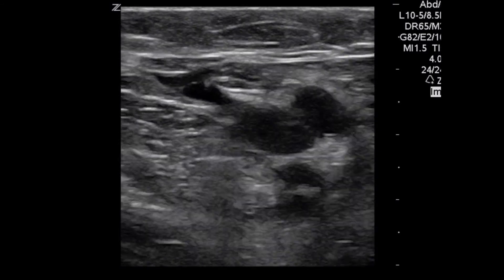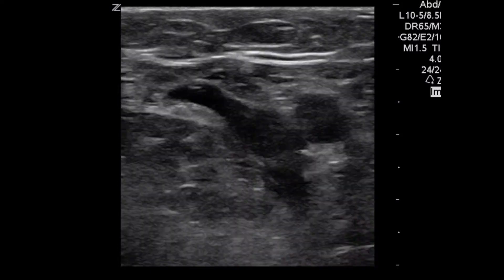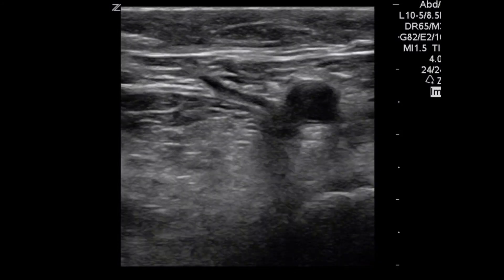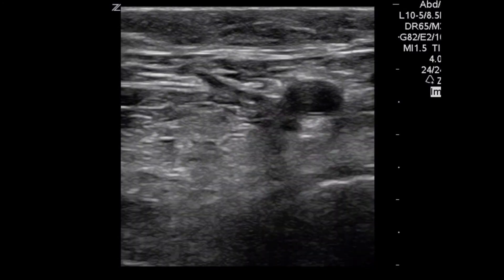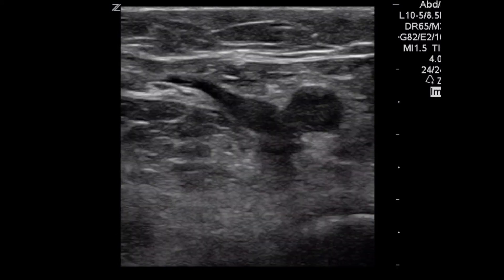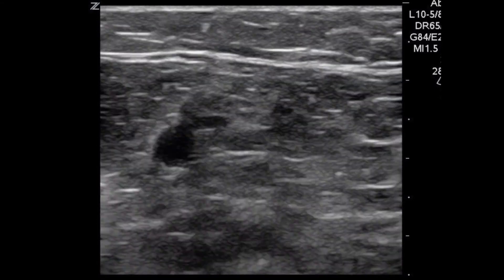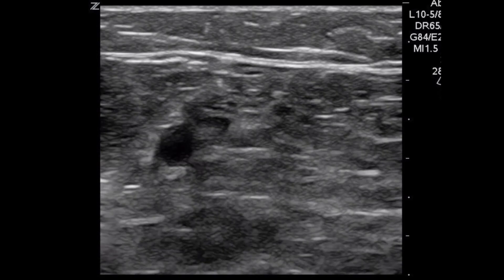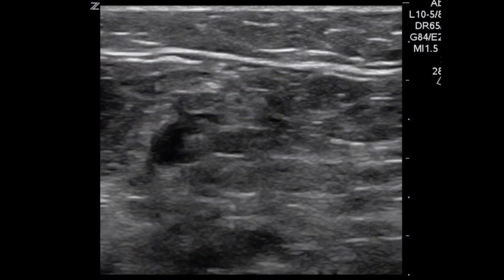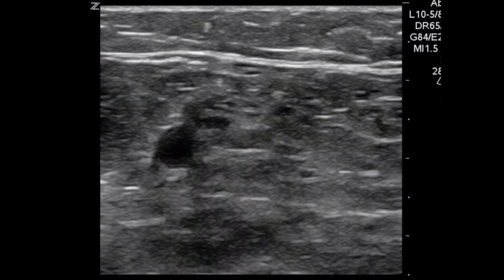Here we are at the common femoral vein region. We're seeing the saphenous vein shoot off from the femoral vein, and you can see the femoral artery as well. What we're doing is compressing — we get those veins in view and push straight down into the patient. If the veins compress 100%, there's no thrombus. If they don't compress, that's how you diagnose the thrombus. Here's the popliteal region — we always use the phrase 'pop on top' to remember that the popliteal vein sits on top of the popliteal artery, which is the anechoic pulsatile structure below. Compressing this one 100% — no DVT.